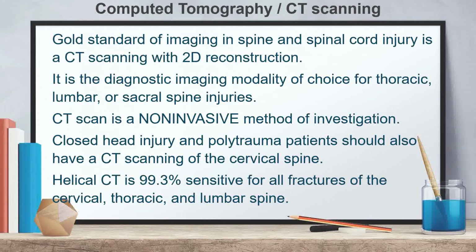In polytrauma patients also, a screening CT scanning of the spine should be done apart from that of chest and abdomen. Helical CT is able to identify 99.3% of all fractures of the cervical, thoracic, and lumbar spine. Those injuries missed by helical CT require minimal or no treatment.